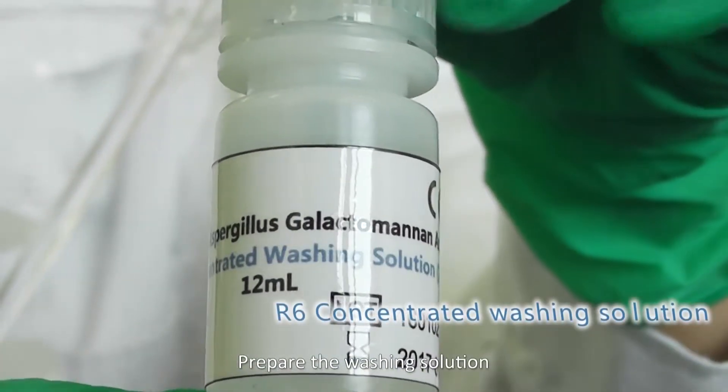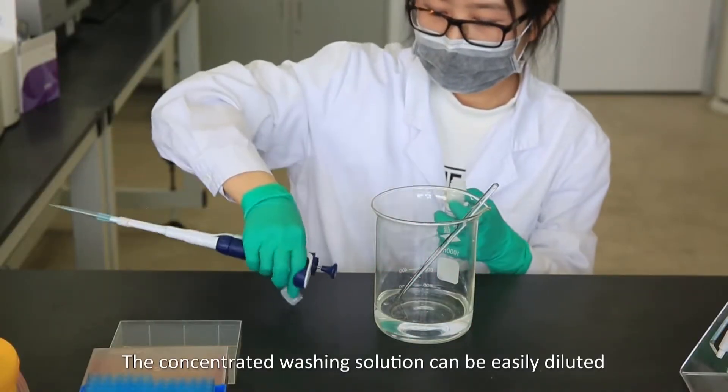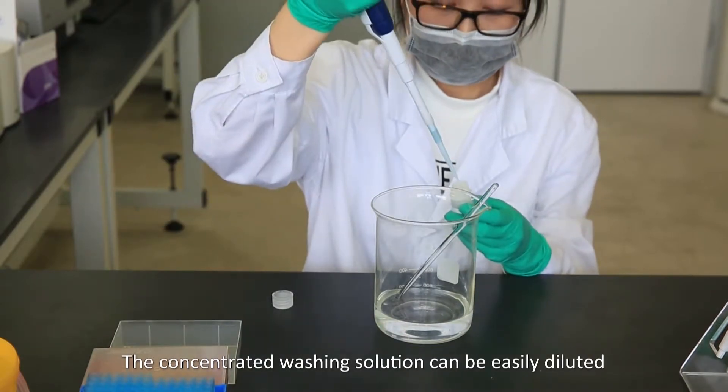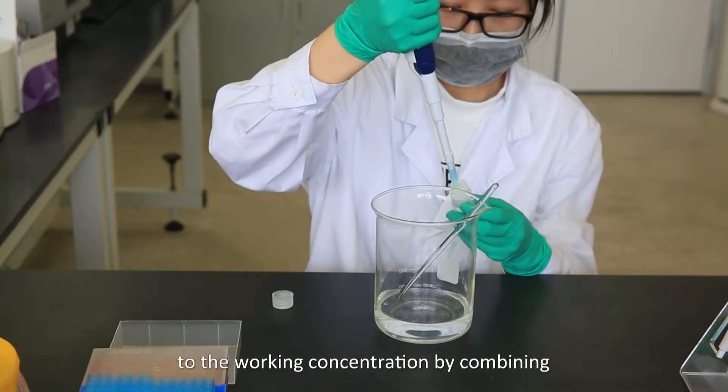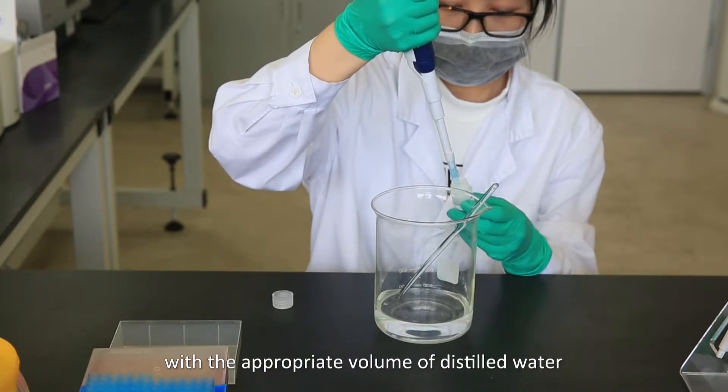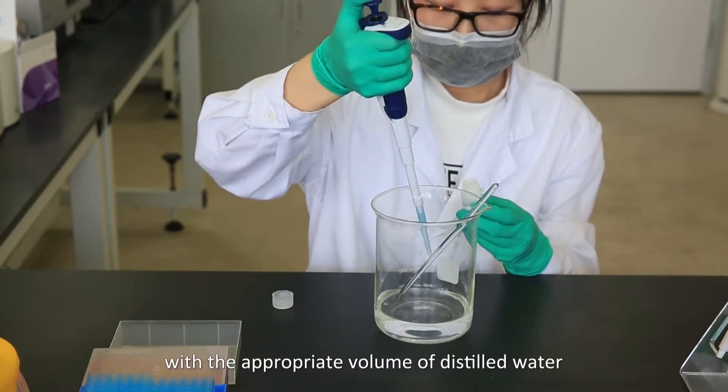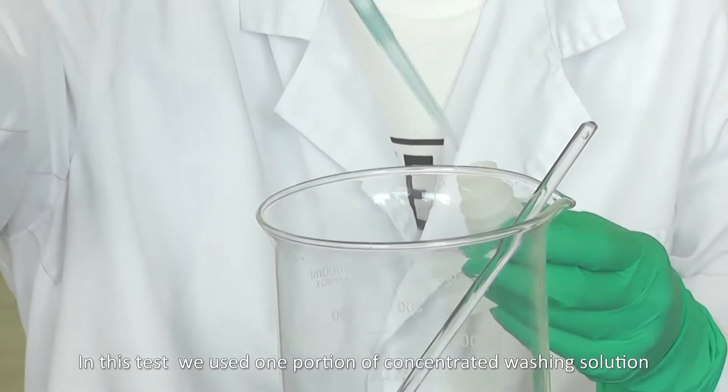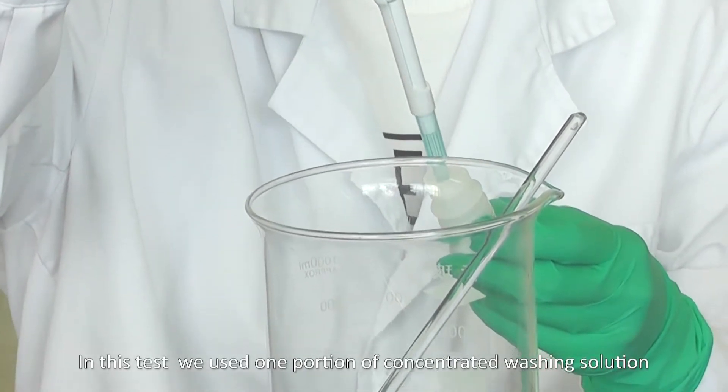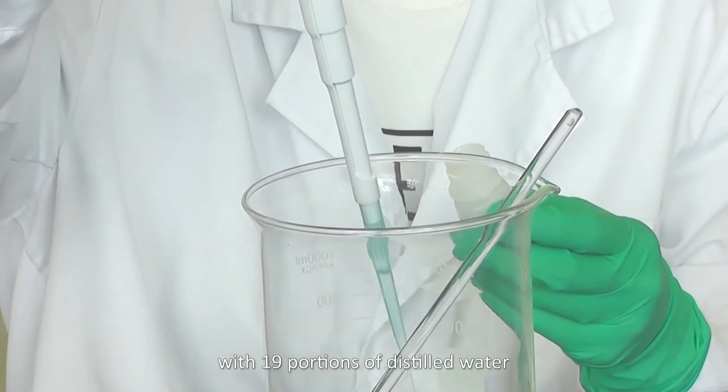Prepare the washing solution. The concentrated washing solution can be easily diluted to working concentration by combining with the appropriate volume of distilled water. In this test, we used one portion of concentrated washing solution with 19 portions of distilled water.